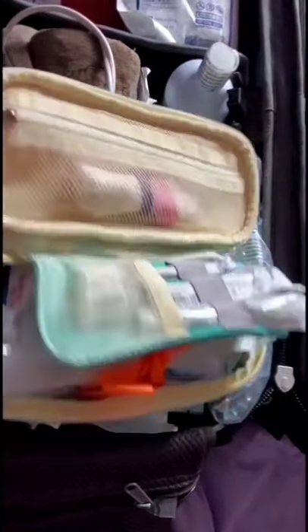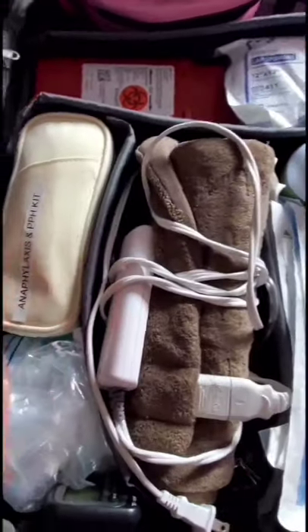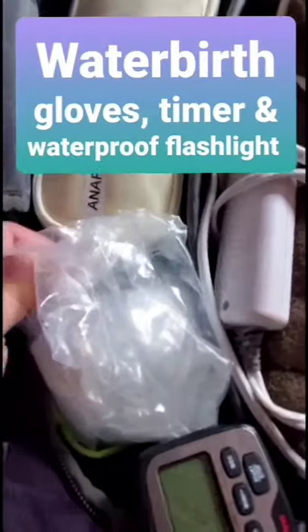With the epinephrine I have a blunt fill needle, a syringe, and a needle for administration — all together. It makes sense that if I have an emergency where I'm starting an IV, those supplies are together and clearly labeled. Right under that kit I've got my normal saline — a one-liter bag — and I keep extra saline in my car as well.